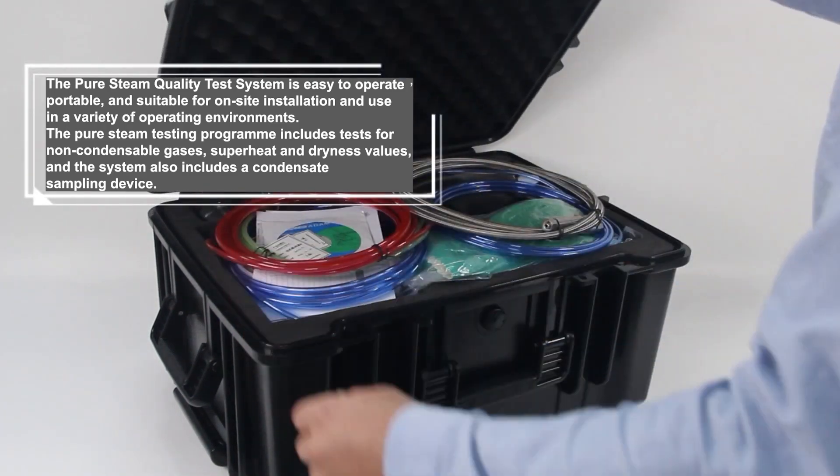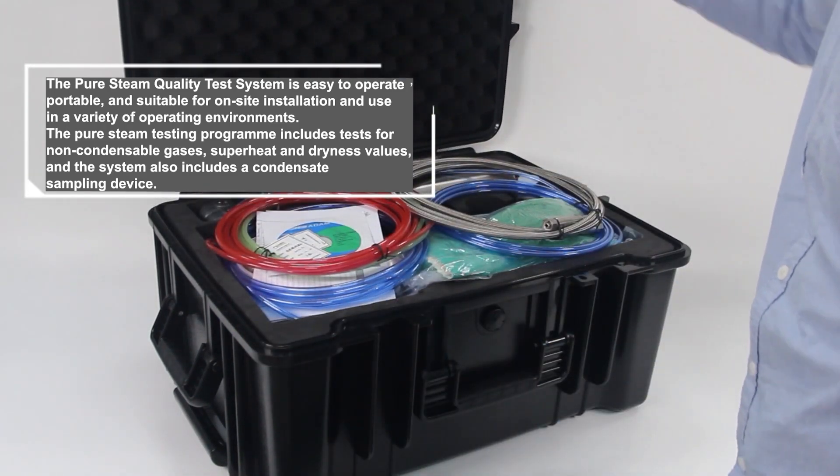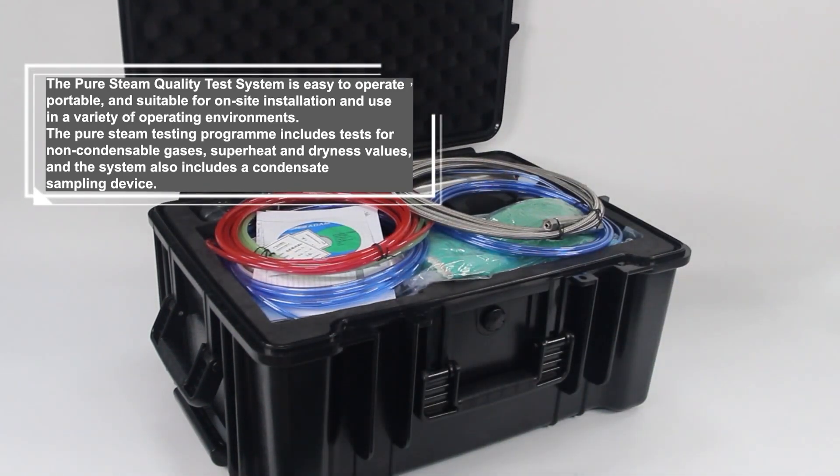The Pure Steam Quality Test System is easy to operate, portable, and suitable for on-site installation and use in a variety of operating environments. The Pure Steam Testing Program includes tests for non-condensable gases, superheat and dryness values, and the system also includes a condensate sampling device.